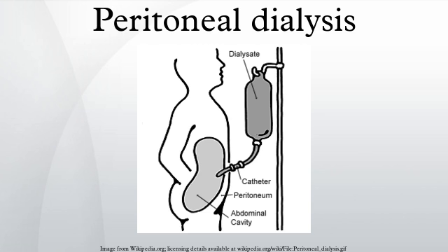Complications: the volume of dialysate removed as well as patient's weight are monitored. If more than 500 milliliters of fluid are retained or a liter of fluid is lost across 3 consecutive treatments, the patient's physician is generally notified. Excessive loss of fluid can result in hypovolemic shock or hypotension, while excessive fluid retention can result in hypertension and edema.